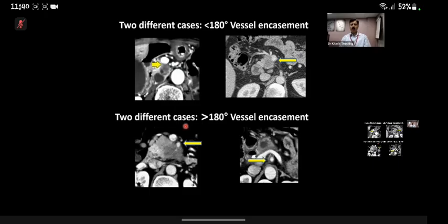Please remember that the criteria, we also learned the criteria in CA esophagus vis-a-vis descending aorta, and there the criteria was different. Interface more than 90-degree was abnormal, or positive. Between 45 and 90 was a gray area. Less than 45 was fine. But here we take 180 degree.